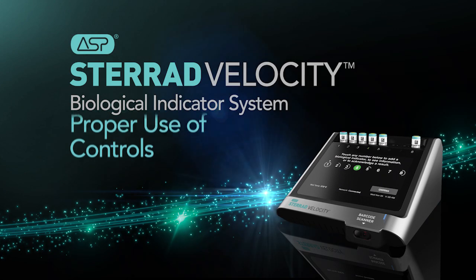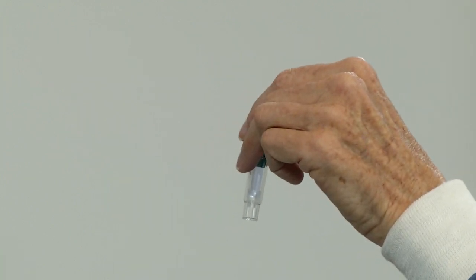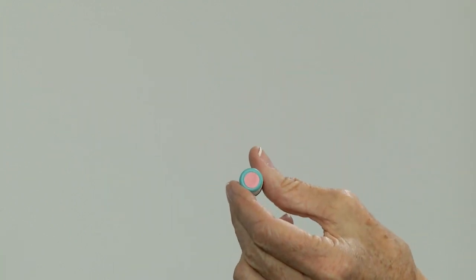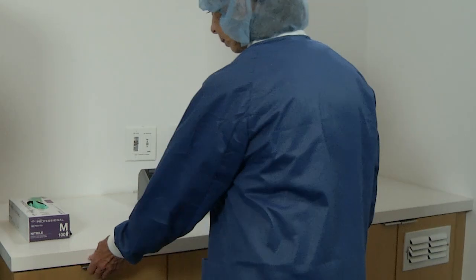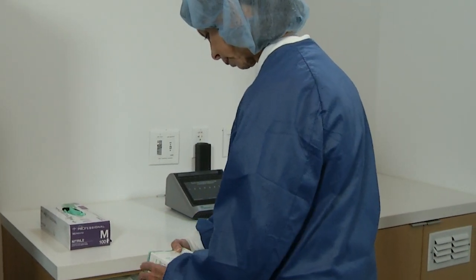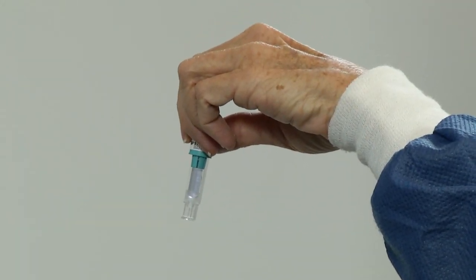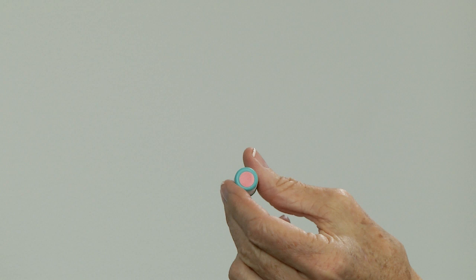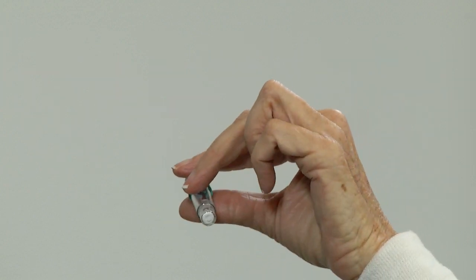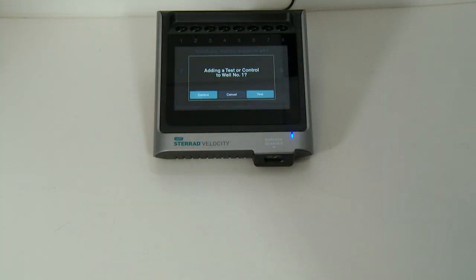A positive control is used to ensure that the biological indicator and the reader are functioning properly. A positive control is an unprocessed STERAD Velocity BI, which is activated and read in the STERAD Velocity Reader. To perform this control, select a positive control BI from the same lot as the test BI. Inspect the positive control to ensure the growth medium is purple, the ampule is intact, the chemical indicator on the cap is red-pink, and the spore disk is lying horizontally in the bottom of the growth reservoir. Next, touch an available well indicator number on the reader's touch screen. When asked what type of BI will be added, touch Control.